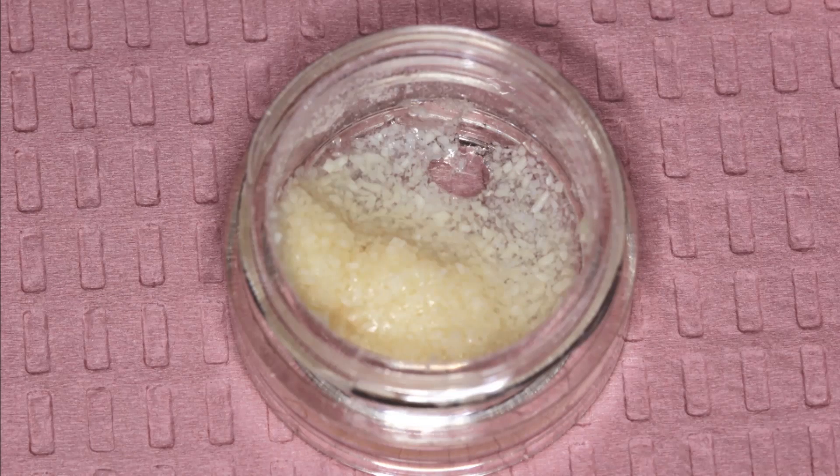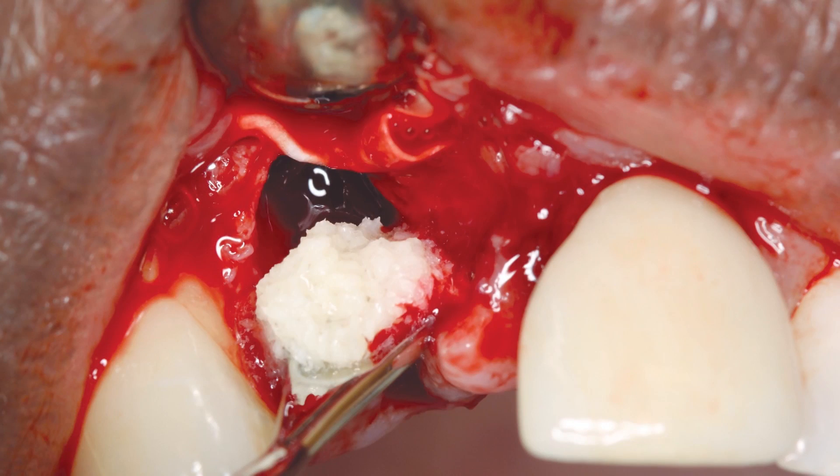To maintain consistent bone volume, demineralized allograft material composed of cortical cancellous particles was mixed with sterile saline to create a paste for grafting. Allograft material has osteoconductive elements that promote new bone growth while maintaining adequate volume. The graft material was packed firmly, but not aggressively, into the socket site. Because the graft has various sized particles which vary in their rates of resorption and bone replacement, the operator should avoid condensing the particles too firmly in order to prevent crushing the larger particles into smaller ones and elevating the rate of resorption.